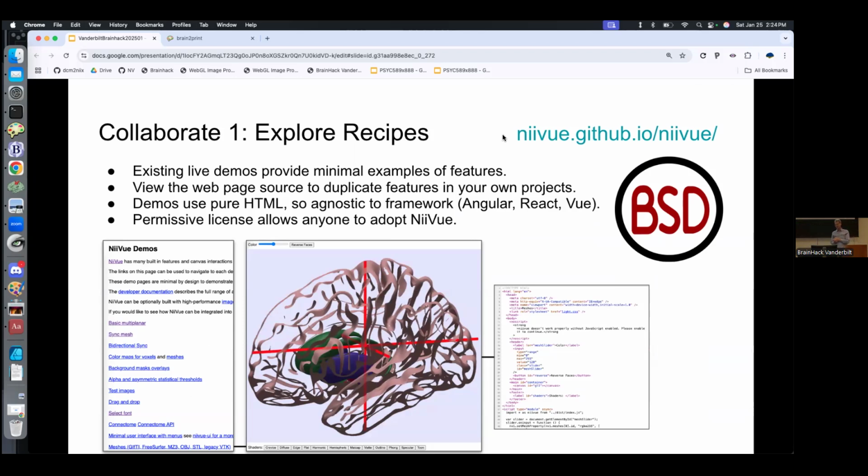The first thing is, we want people to engage and use this. And so my model for how we try to distribute this is a cookbook, a recipe book, where you can browse through. We put in lots of different features here, but just like a cookbook, you can flip through the pages and see a recipe and say, oh, I want to try that. Or at least I want to riff off of that. I like this as a starting point, and I'll change from it, right?